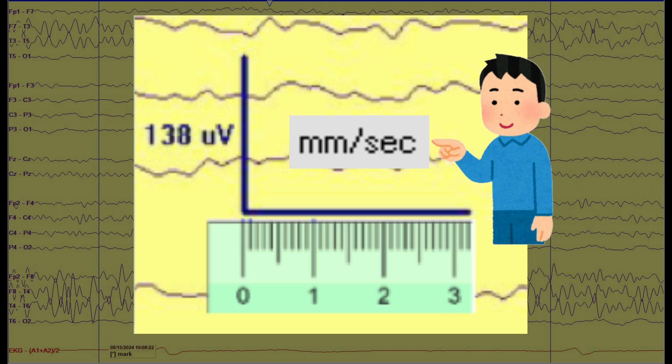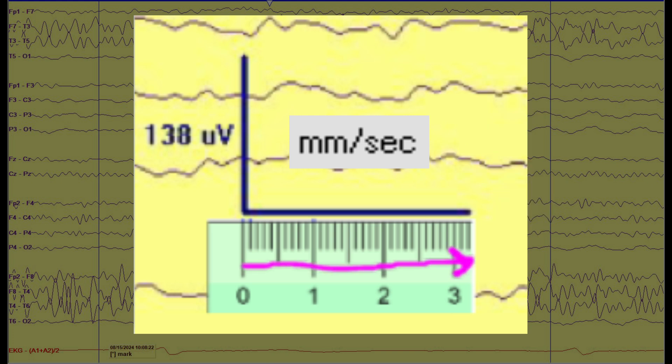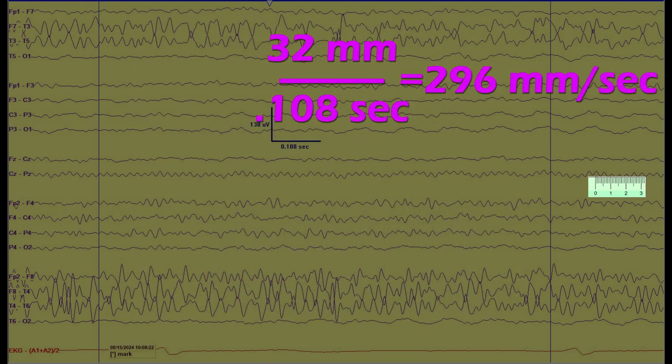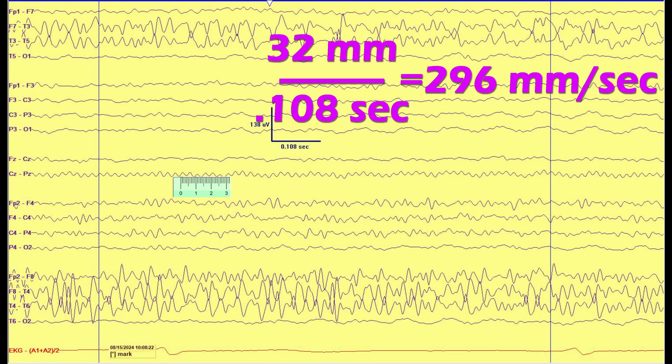They tell you the formula right there for time base and sensitivity. Time base is millimeters divided by seconds. So we need to measure the millimeters of this horizontal line and then divide it by the seconds that are given to us, 0.108 seconds. When I measured this line, I found it to be 32 millimeters. So 32 divided by 0.108 is 296 millimeters. That'd be 296 millimeters per second.